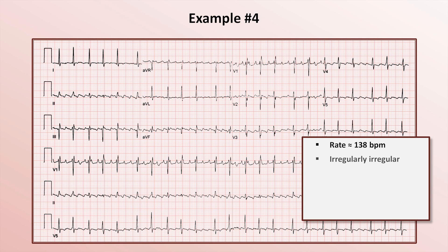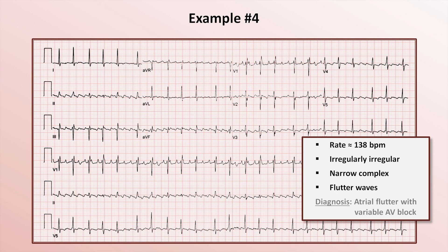It is irregularly irregular and has narrow complexes. The atrial activity shows flutter waves at a rate of about 300, best seen in the inferior leads and V1. Therefore, this tachyarrhythmia is atrial flutter with variable AV block.